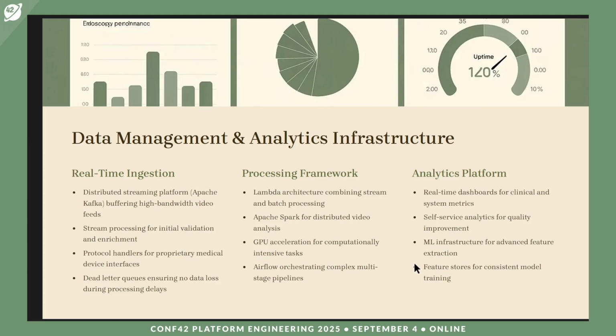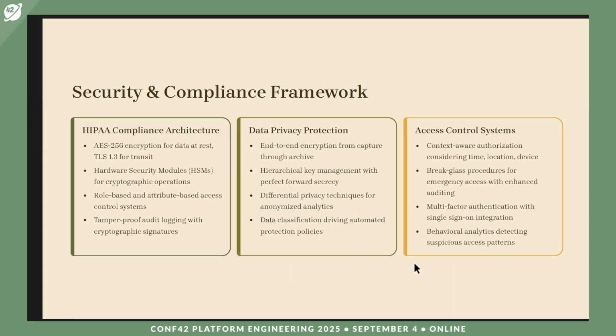Analytics platform: self-service analytics for quality improvement, feature stores for consistent model training. Security and compliance framework: HIPAA compliance, AES-256 encryption for data at rest, hardware security modules, role-based and attribute-based access control systems, tamper-proof audit logging with cryptographic signatures.